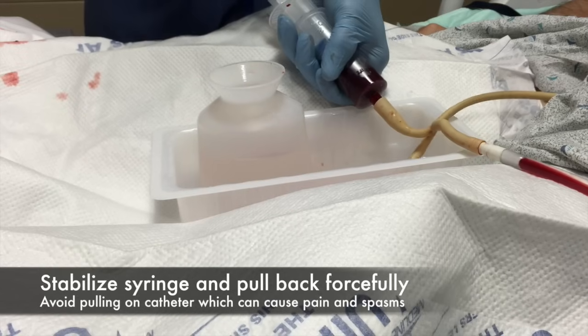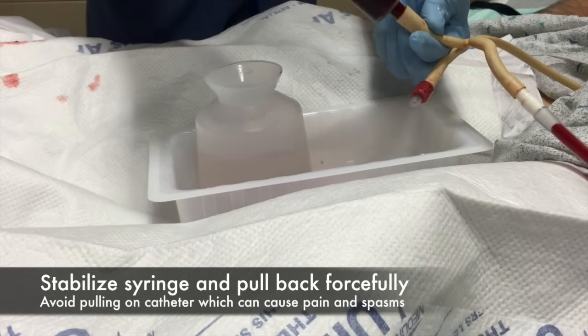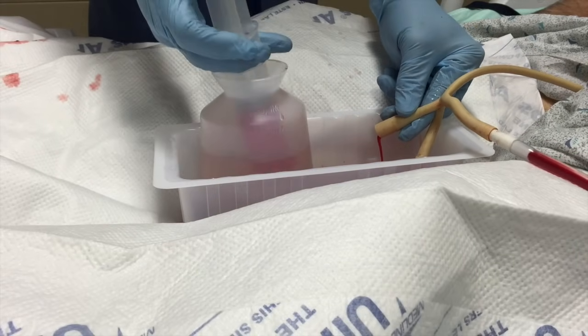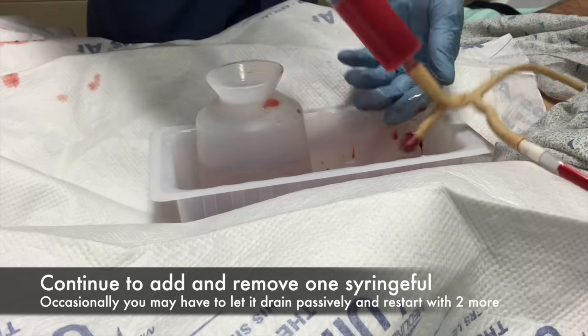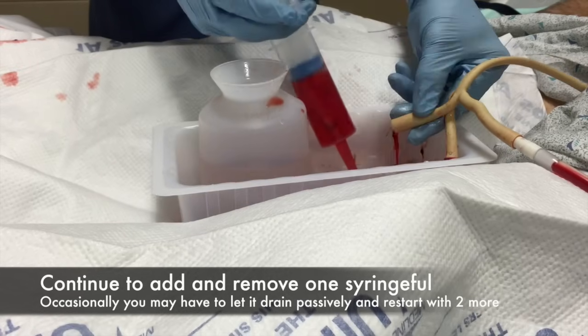Eventually, when the clots are all cleared out, we can start that running, but it's never a good idea to run it until all the clots are clear. If you do, the patient is going to have a risk of perforation of the bladder if you run the irrigation when there's no way for the fluid to get out.